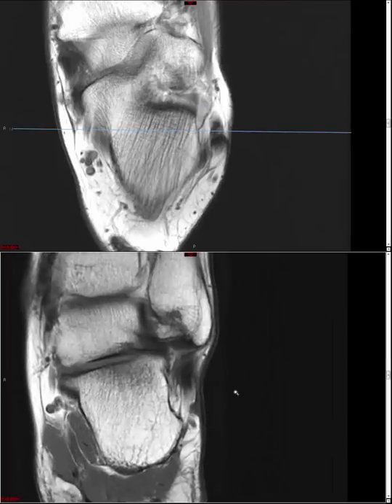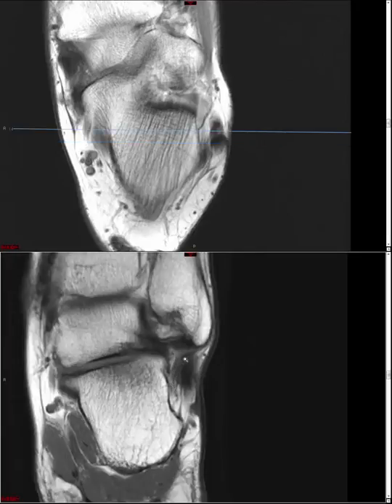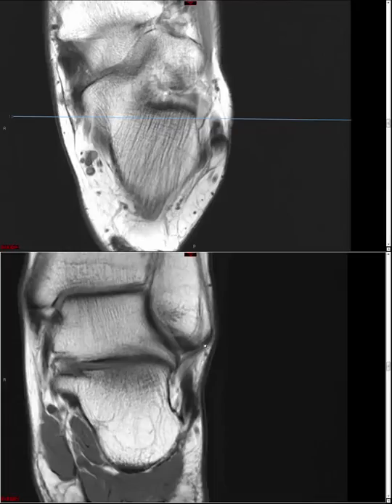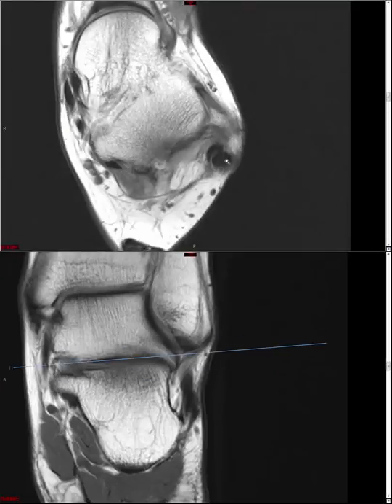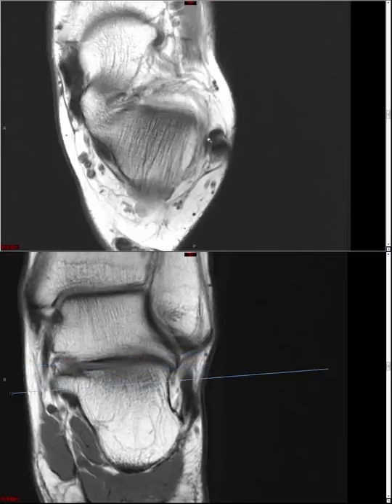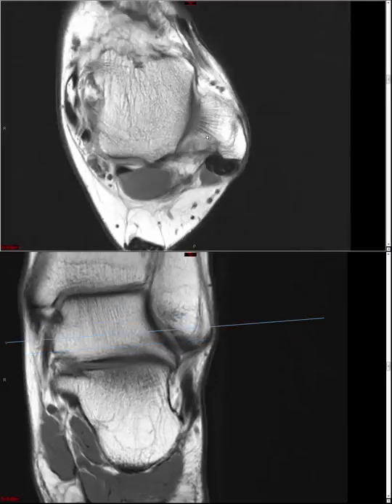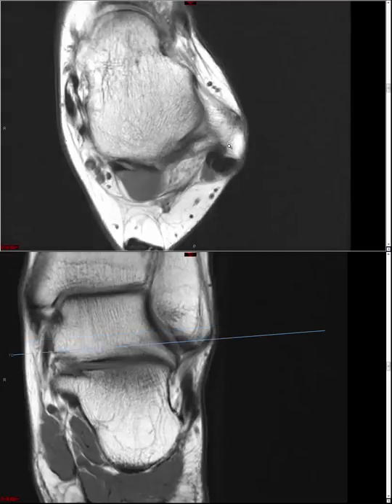On the coronal, we can also find the calcaneofibular ligament — starting at the calcaneal attachment, then scrolling anteriorly, it ducks in front of the peroneal tendons and attaches to the lateral malleolus. In general, these lateral ankle ligaments tear from anterior to posterior: ATFL first, then CFL, then less commonly PTFL. It's not impossible to have an isolated CFL tear — that's been described — but it's less common. So at the level of the lateral malleolus is where we assess our lateral ankle ligaments.